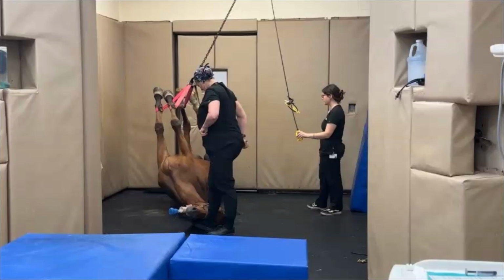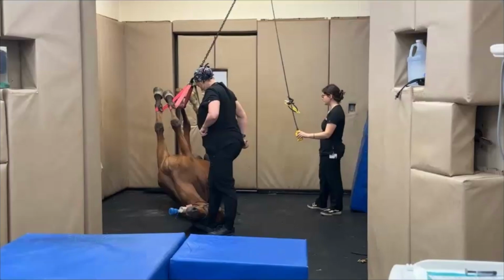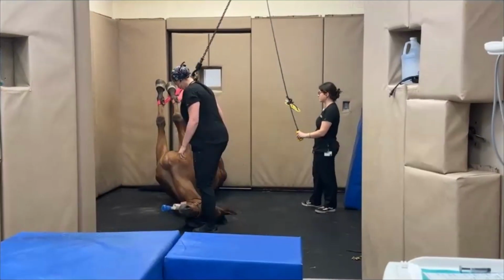We've got a great team of technicians here. One of these is an anesthesia tech. The other ones are surgery techs. They know exactly what to do. And you're right, with a hoist, you don't need a lot of muscle on the people. You need some, you still have to position them on the table, but the hoist is huge. Okay, we'll continue with the video.